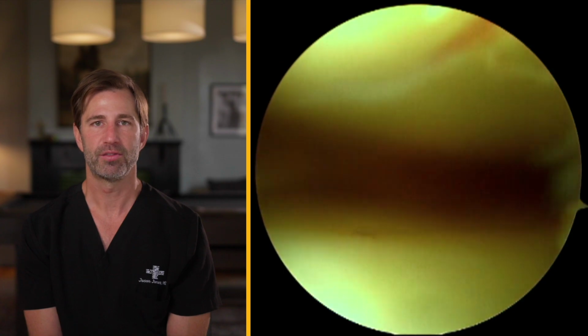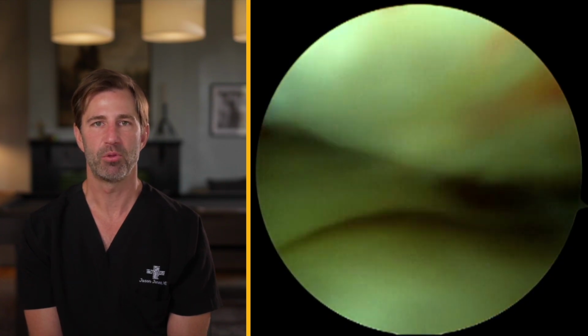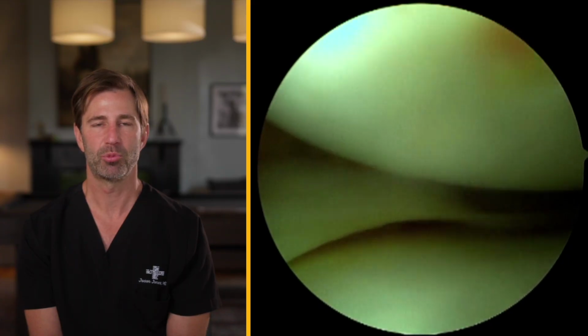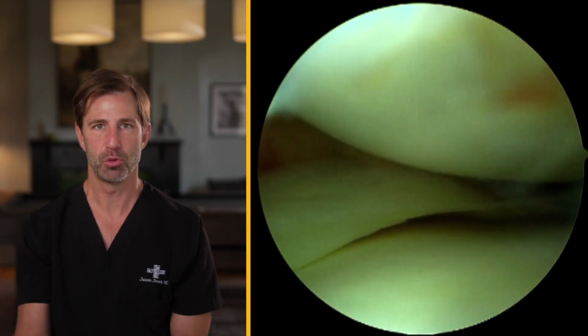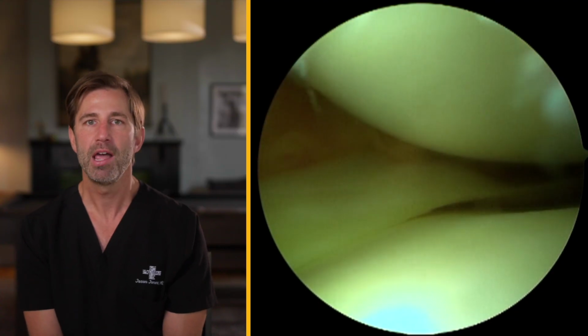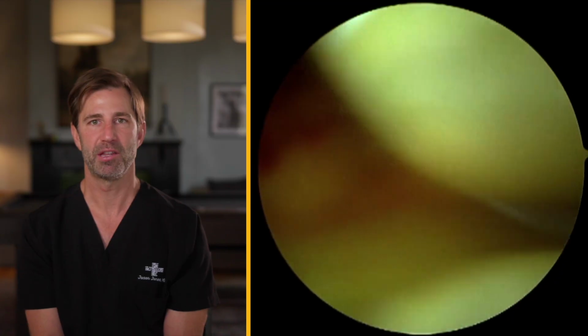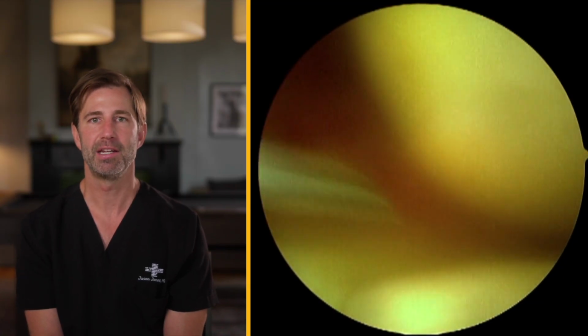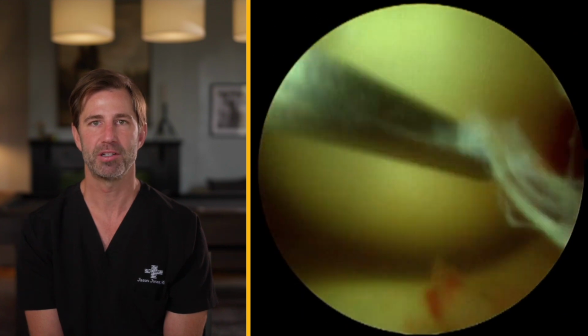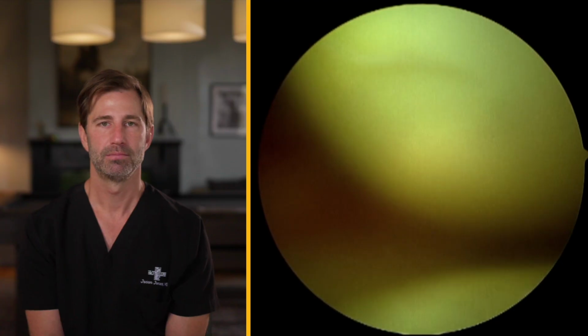In the initial part of this video, what we've done is we've positioned the knee. This means that we put the knee in the best possible spot for us to do the surgery on. In general, what we do is we place this in what's called a leg holder that holds the upper portion of the leg still, and then we're able to manipulate the lower portion of the knee. This allows me to stress the inside and the outside of the knee and allows me to gain access to parts of the knee that I otherwise would have difficulty obtaining access to.